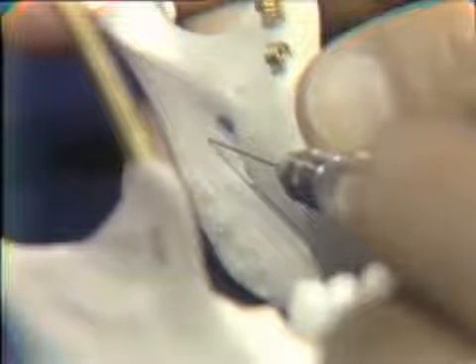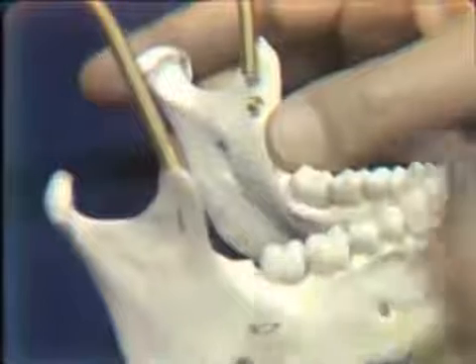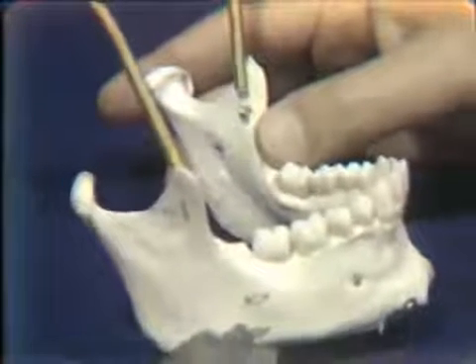We carry on in and then attempt to get the needle bevel against bone with a light touch, approximately 2/3 of the distance from the anterior to the posterior border. Then we would aspirate naturally and inject the solution slowly, which we will demonstrate on the patient.